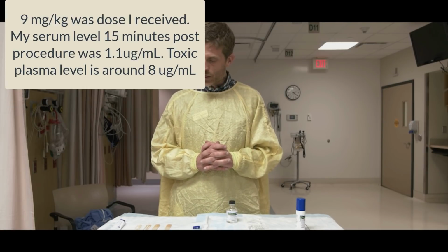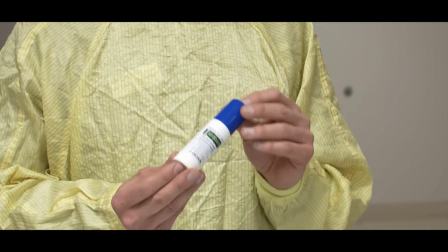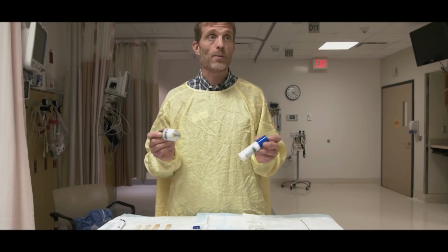So the other thing that is sometimes used is this lidocaine. This is 10 milligrams per spray. It's actually 10%, but it works out to 10 milligrams per spray. So it's quite highly concentrated. You're going to get to your toxic dose sooner. You don't generally need that high a concentration to adequately topicalize the airway. 4% is more than adequate, and there's been research literature published around that.